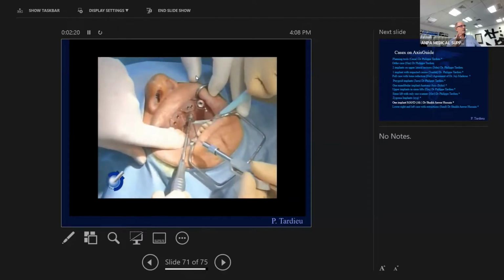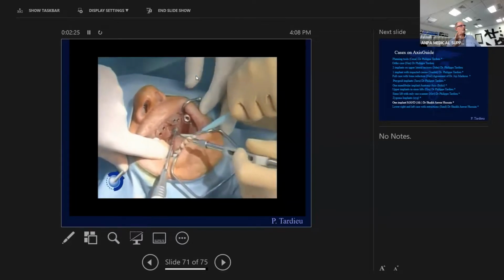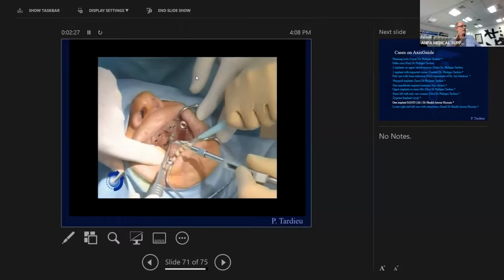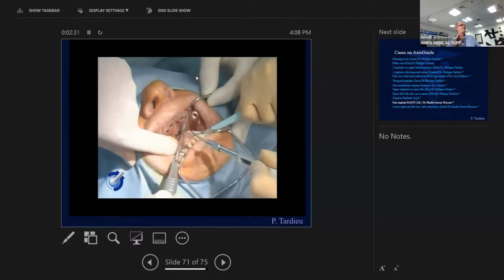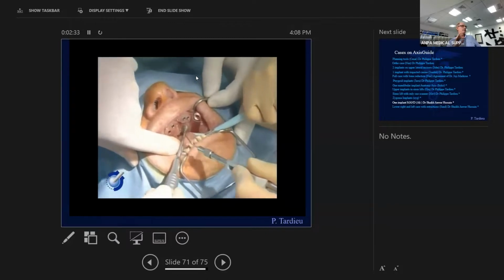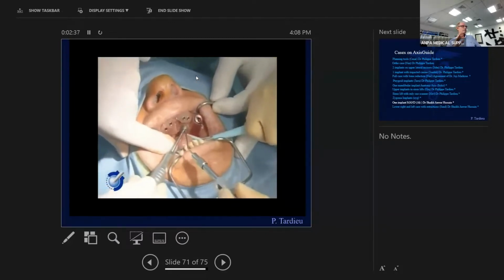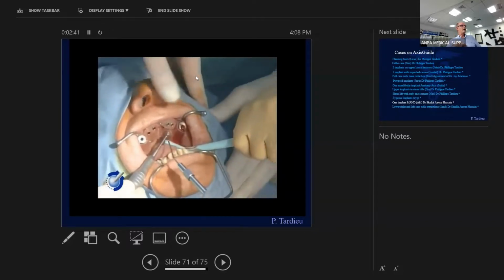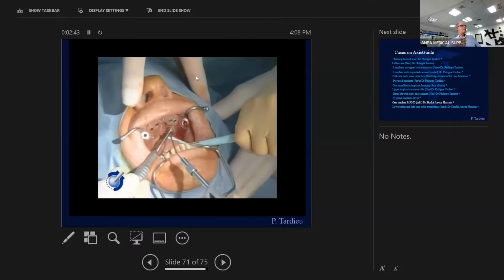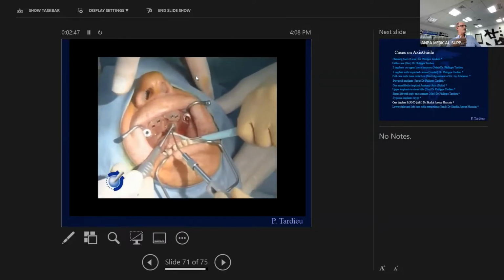and then we do the same on the other side, exactly the same process, the same surgical guide, the same stabilized guide, and I go inside the sinus. It's empty now, and I feel the Zygoma eminence and drill inside the Zygoma eminence. So voila, here, I place it, and this is in real time. We did not cut anything, it's in real time.